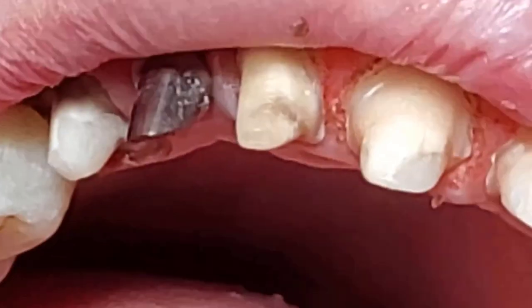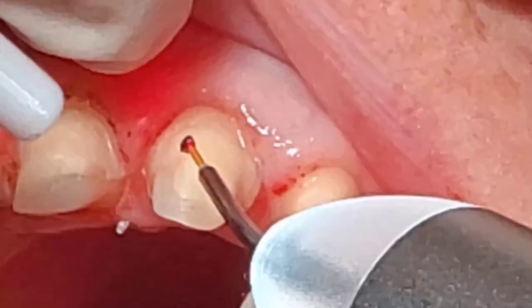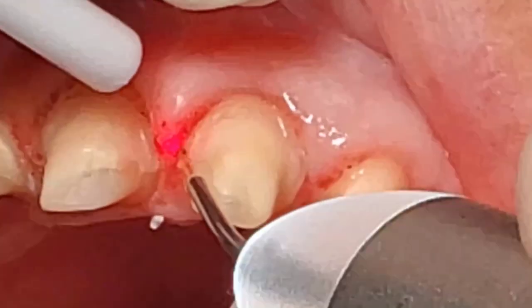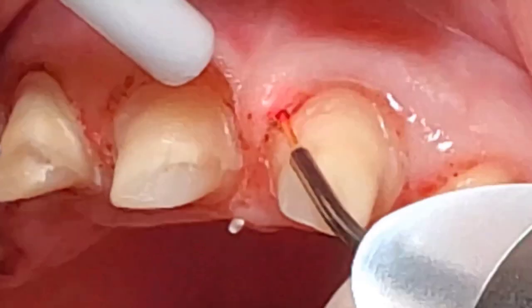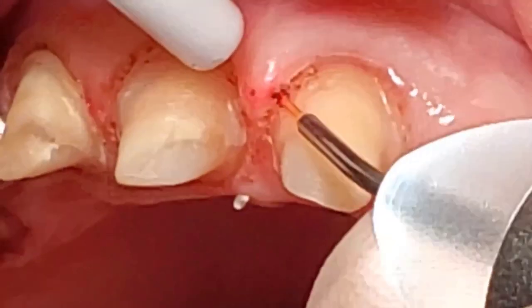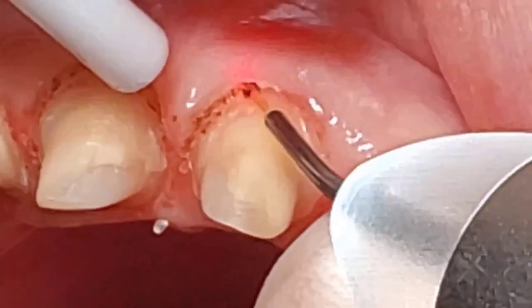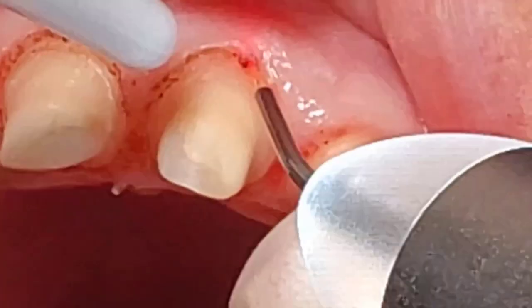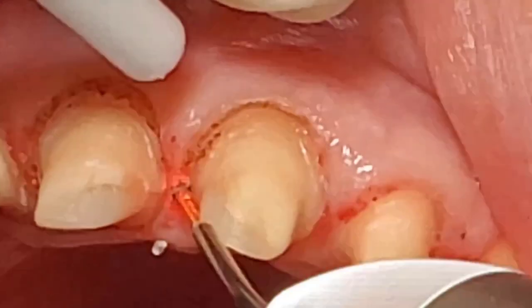Now I can drop my margin. I can do whatever I want to do here to get me to the finish line, so to speak. Now we're at 980. Just for demo purposes, I use the 980 to show you. You likely won't be able to tell the difference in cutting. 980 is 0.6. Again, even here, you don't see any bleeding. It cuts. You do not see any bleeding.